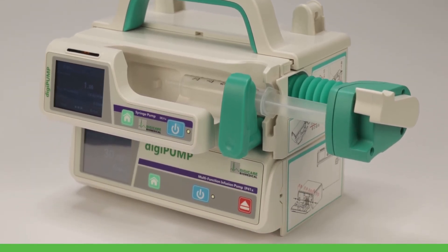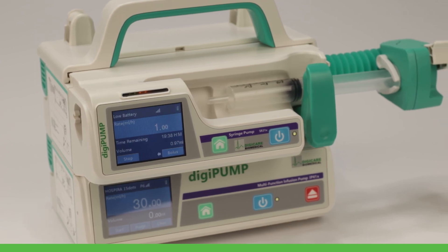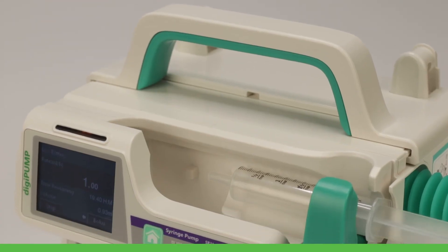The pump can be purchased with an optional workstation and can be paired to a central station via Wi-Fi, allowing for simultaneous monitoring of up to 18 pumps.